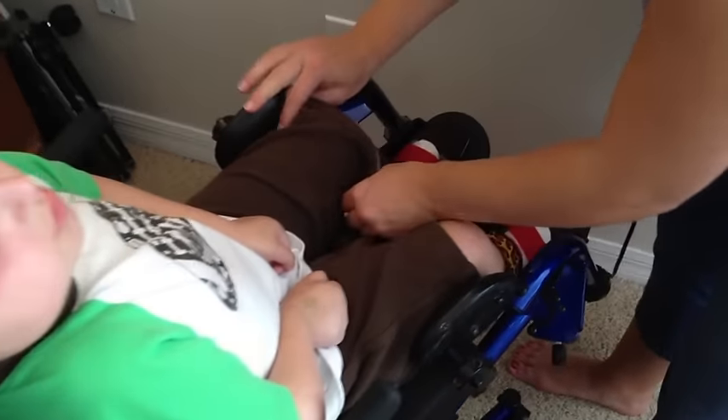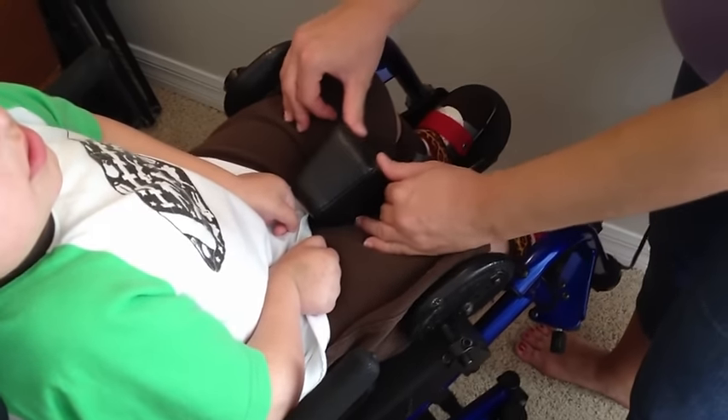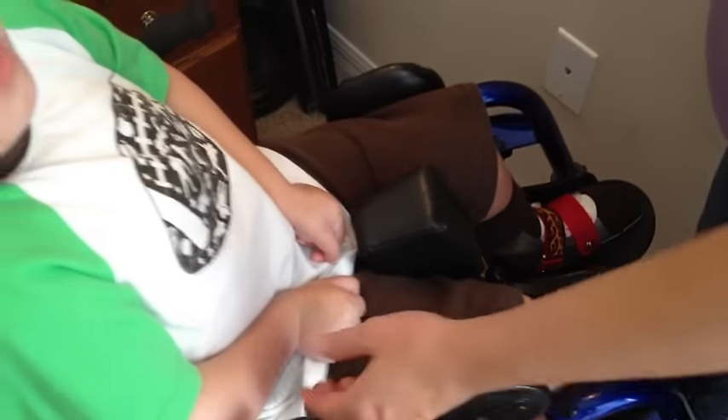You're going to want to bend his legs, get him in the stirrups, and bring the little piece up here in the middle to help protect him so that he doesn't fall out of his chair.